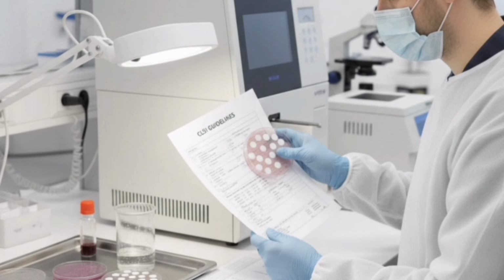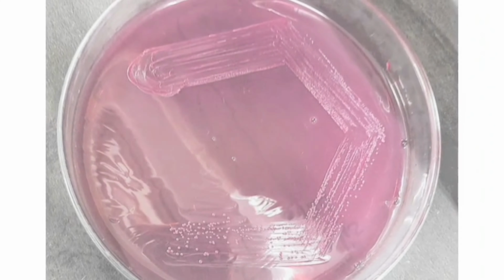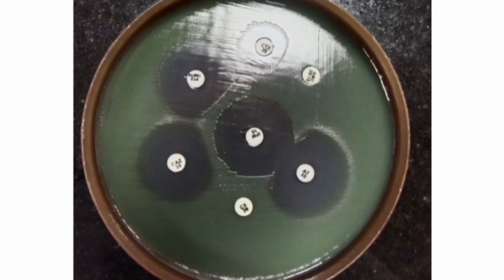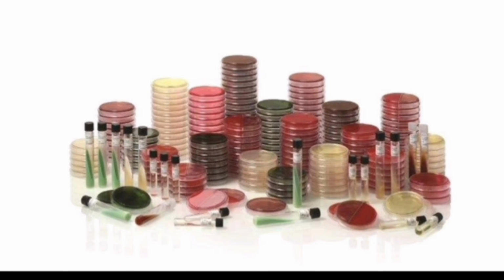Let's see how the QC strains should be used. Grow the QC strains on the same media you use for patient samples. Compare their reactions, especially the colony morphology, pigmentation, biochemical result, zone diameter, and their growth patterns. If QC behaves exactly as expected, the media or the test is valid. If not, then reject the batch, recheck, or troubleshoot.